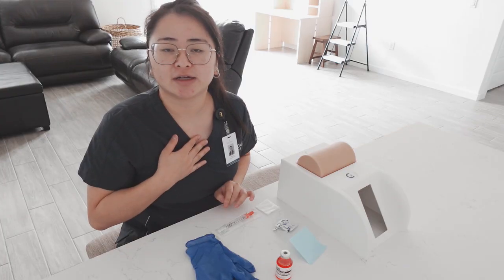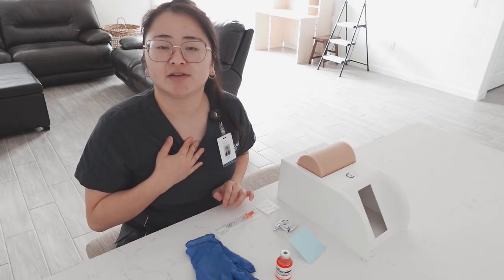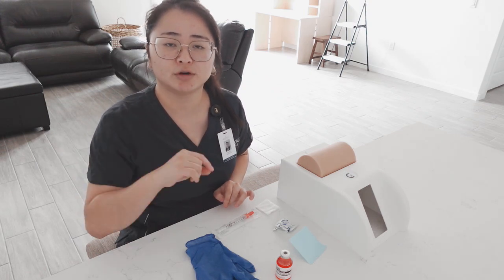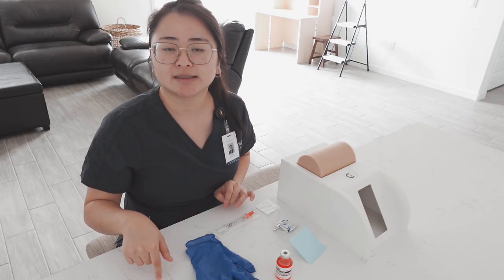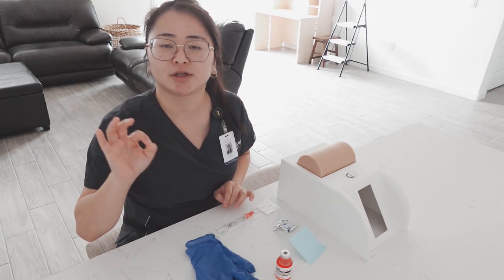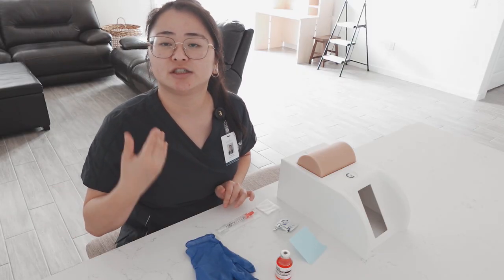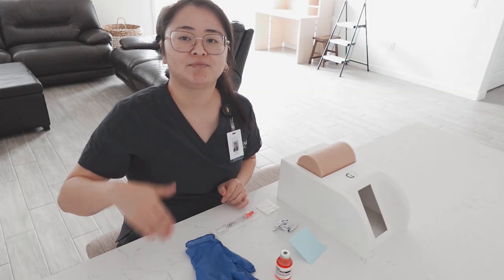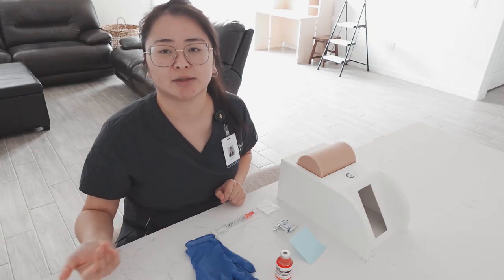The medication I have on hand is tuberculin purified protein derivative, 5 tuberculin units over 0.1 milliliters. The order that is given or prescribed to the patient reads a tuberculin skin test, 5 tuberculin units over 0.1 milliliters, intradermal injection times 1 dose. If I've done my math correctly, it is 0.1 milliliters. That is the 1 dose I'm supposed to give the patient.